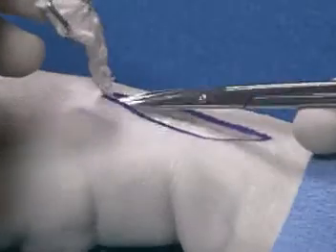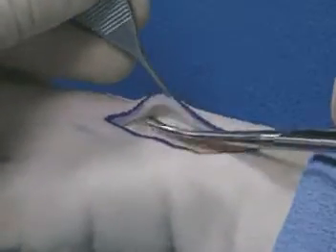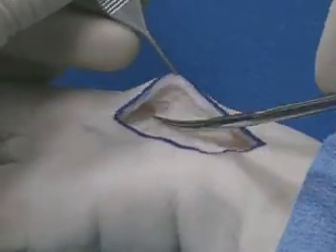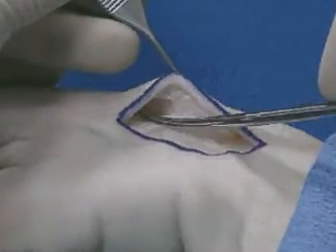In order to allow the tissues to come together during the closure, undermining is necessary. When scissor dissection is used, the tips of the scissors are best kept tip upwards towards the skin edge so that the deep structures are not inadvertently cut.